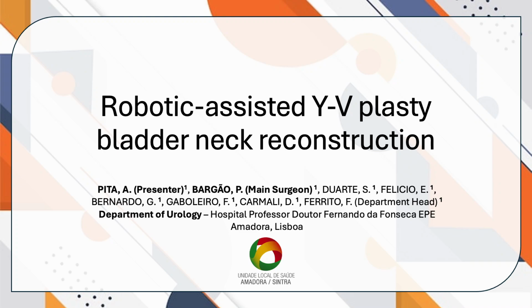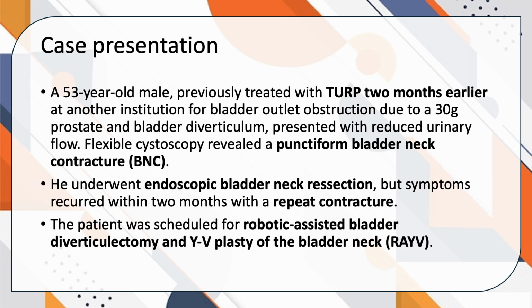We present a surgical video of a robotic-assisted Y-V plasty bladder neck reconstruction recorded at our institution. The case is a 53-year-old male who underwent a TURP at another hospital 2 months before coming to us. He complained of worsening urinary symptoms, mainly poor flow.